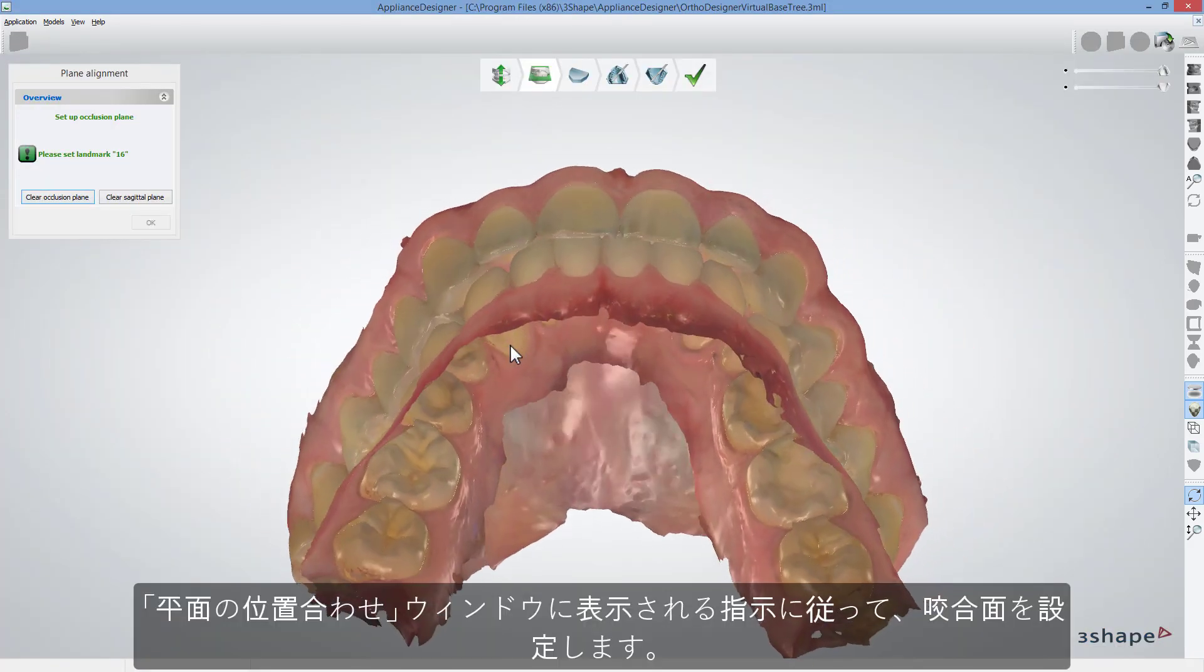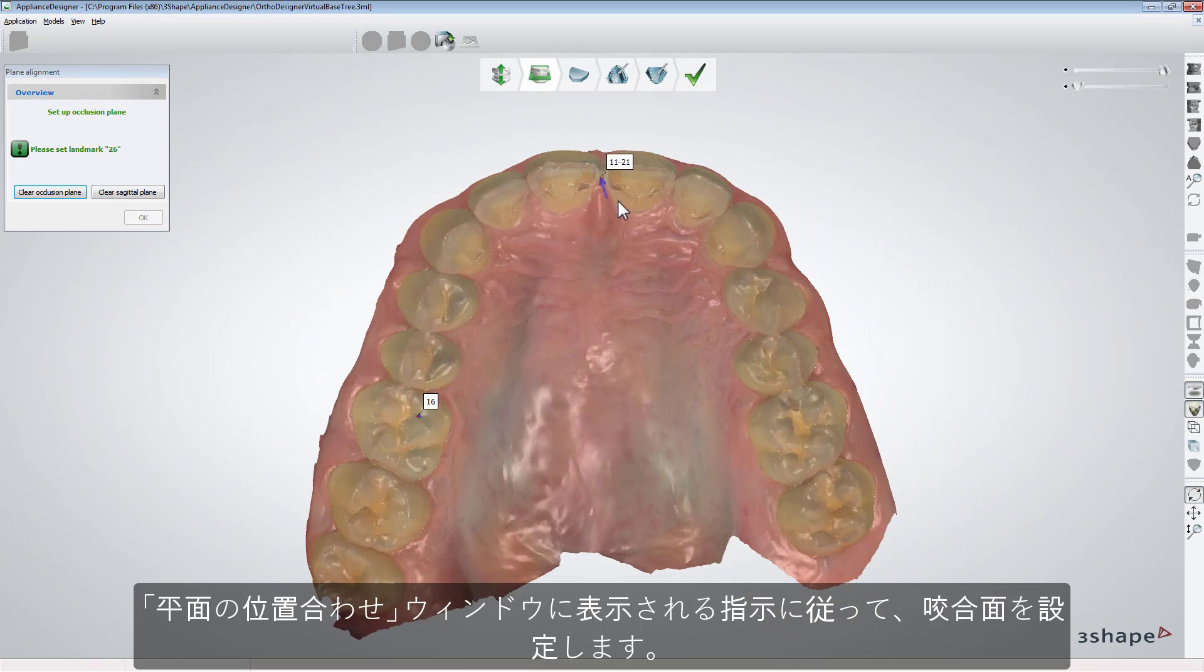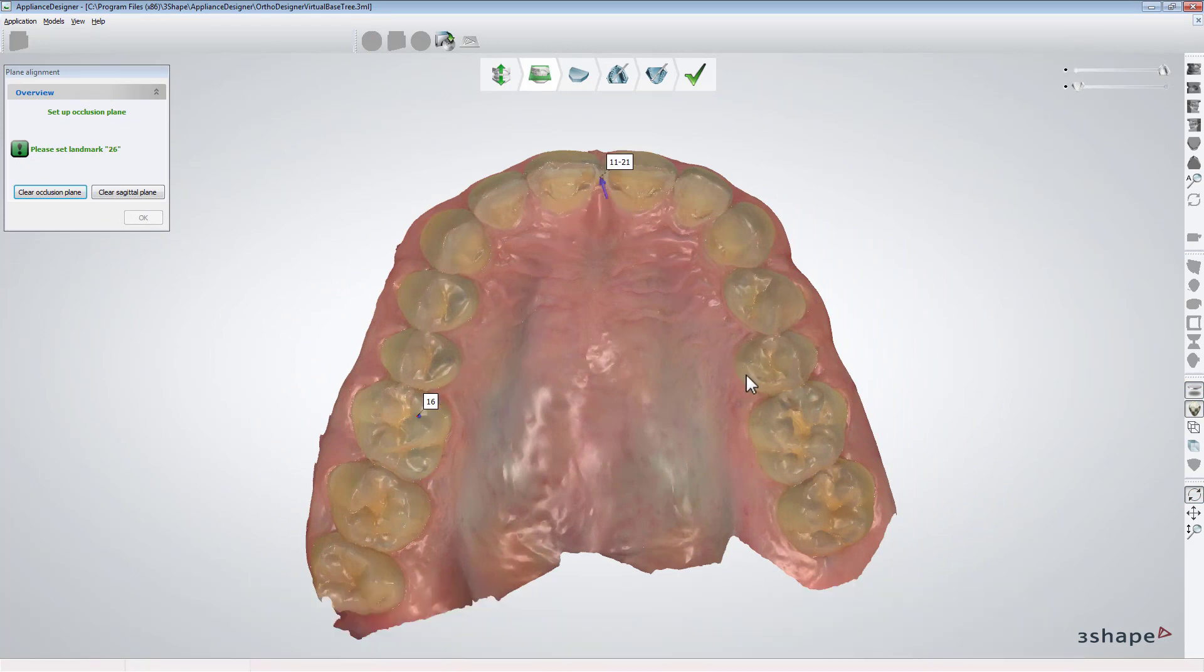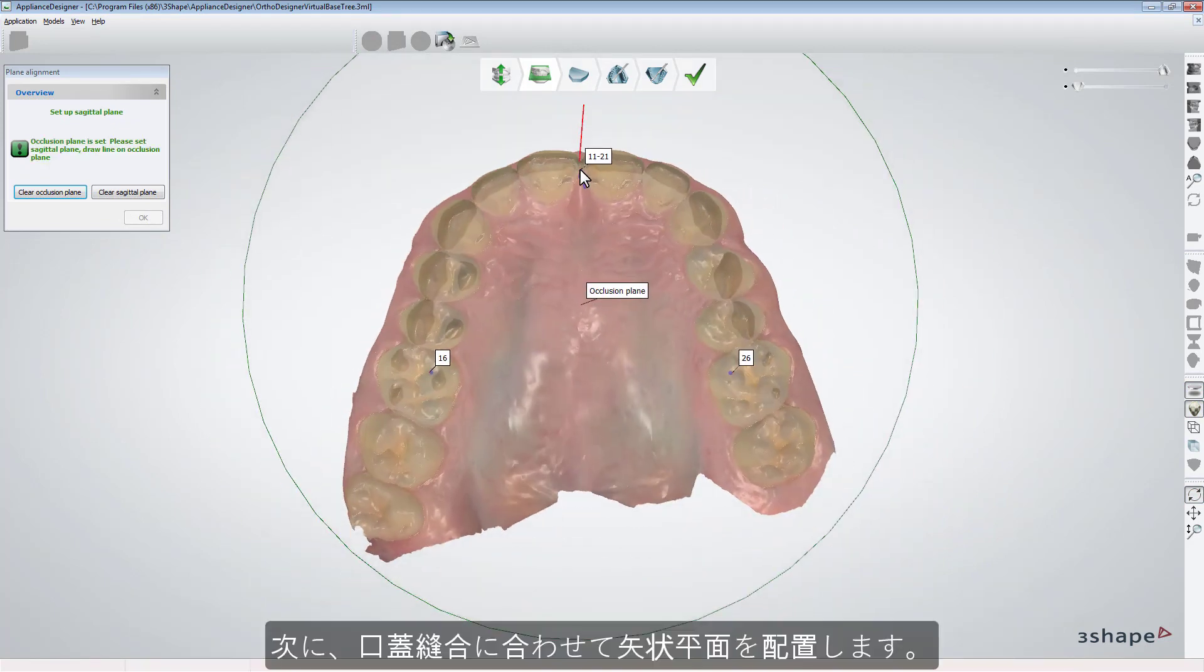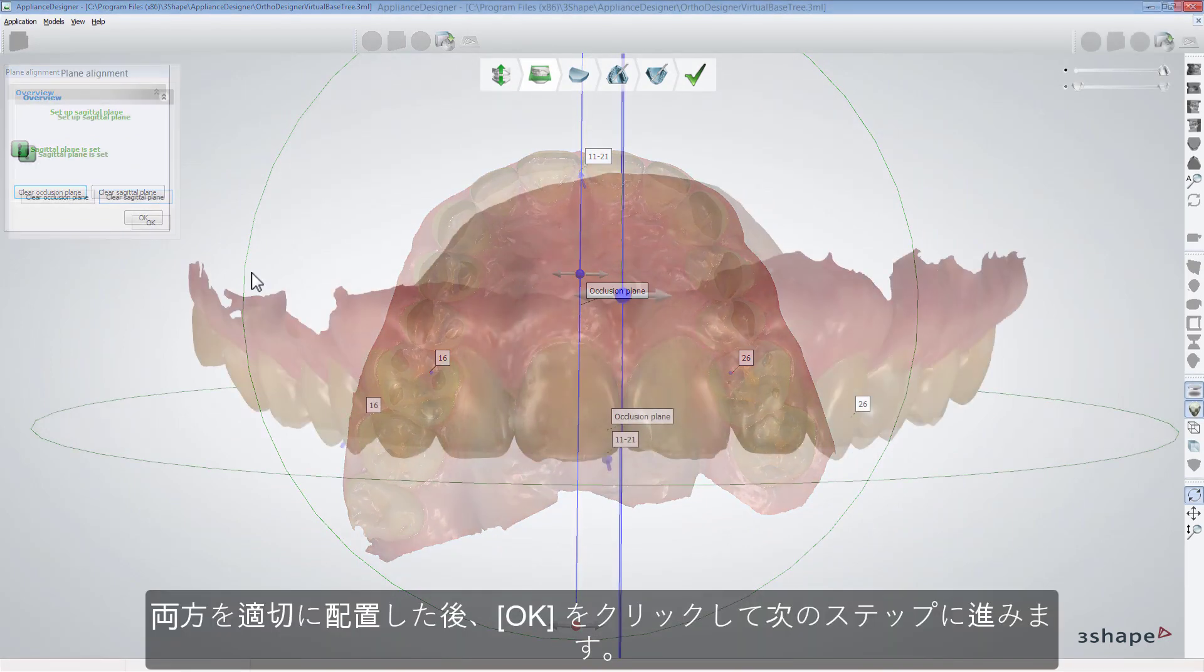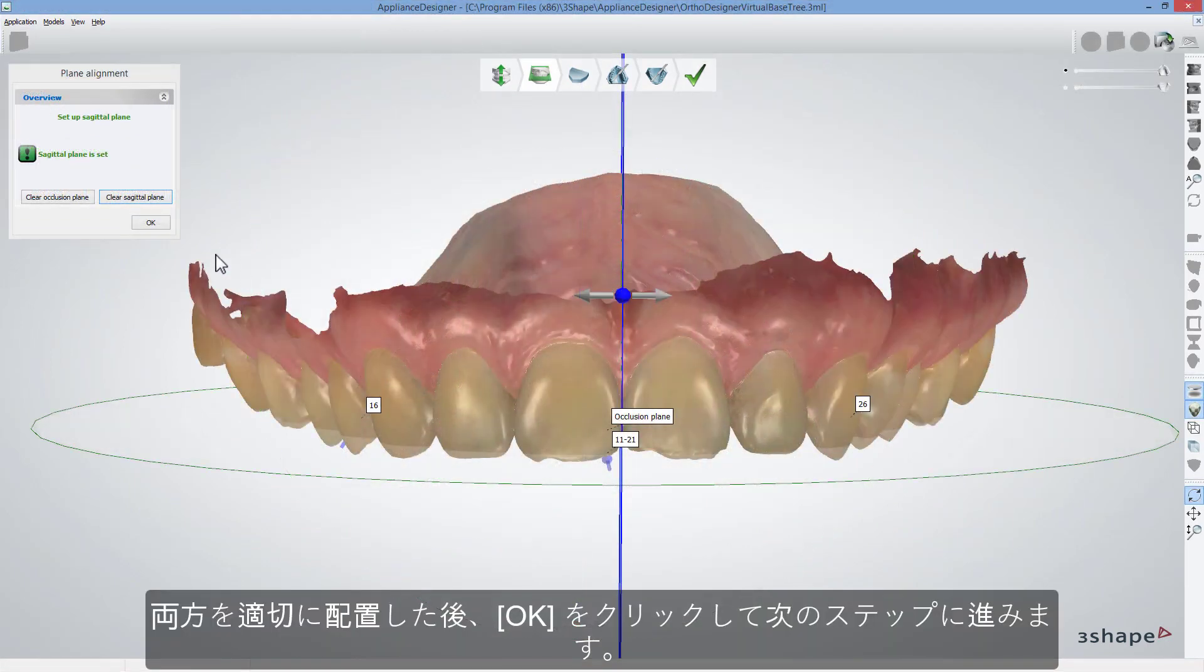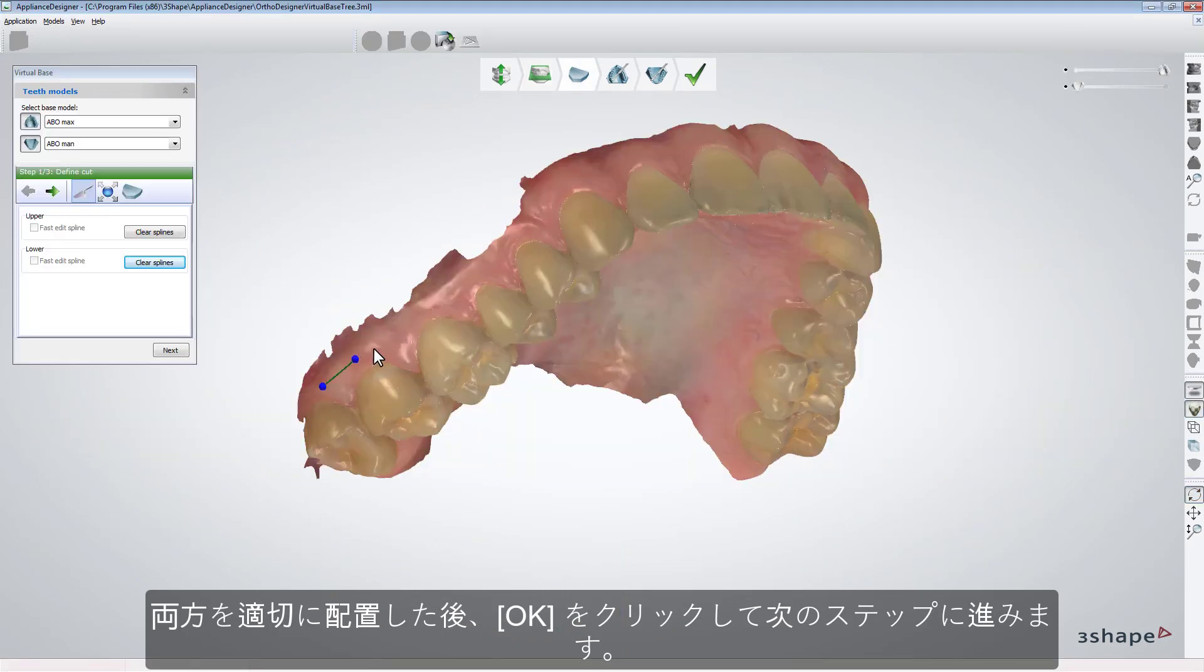Start with setting the occlusal plane following the guidance in the plane alignment window. Then set the sagittal plane along the median palatine suture. Having both of them set correctly, click OK to get to the next step.